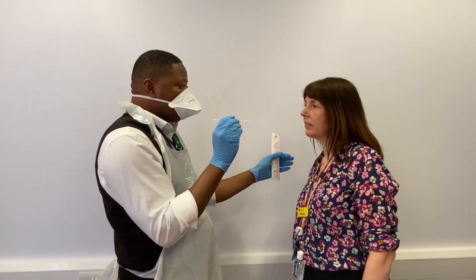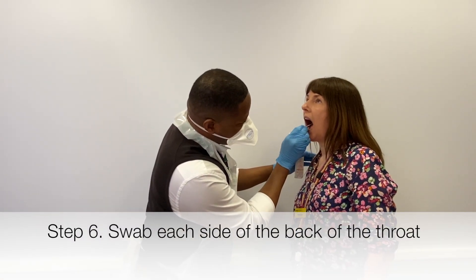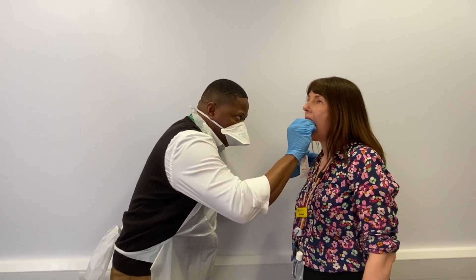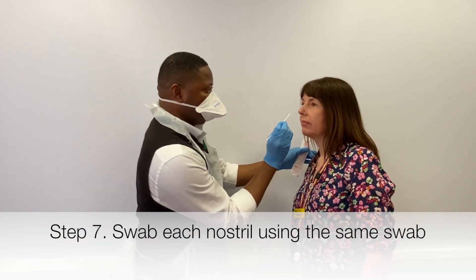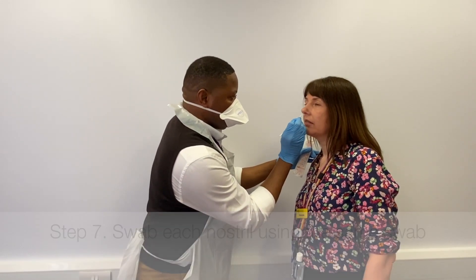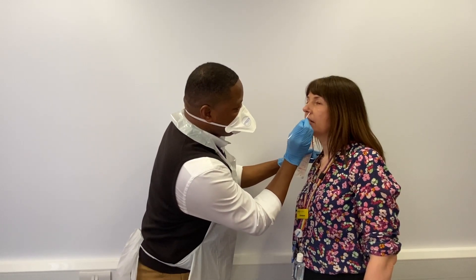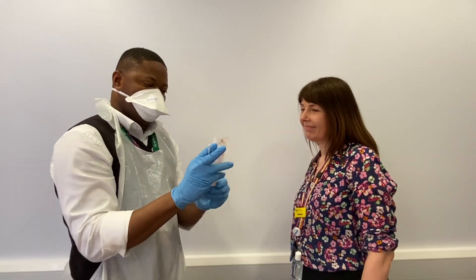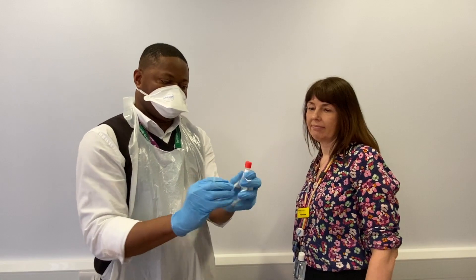If you just open your mouth for me — thank you. Now I'm going to do your nose with the same swab, using a nice circular motion, just to be careful. Now I'll take in the swab — it goes into the rest of the tube there.